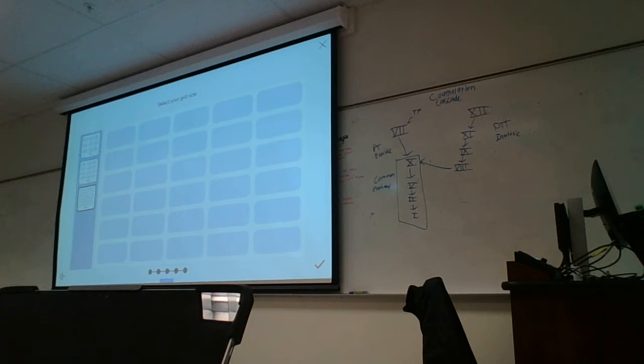Within the aphasia page set, you do have these 3 different types of grid sizes. When you look at the grid size, and that could be across any access method, so if it's eye gaze access, touch access, or switch scanning, you'd want to see what the patient or the client is able to do. So if they could target smaller buttons, you might want to go with the 6x5. If you want to maybe start them with a 3x3 just to teach them where things are and give them bigger targets to hit, then you would start with that size.